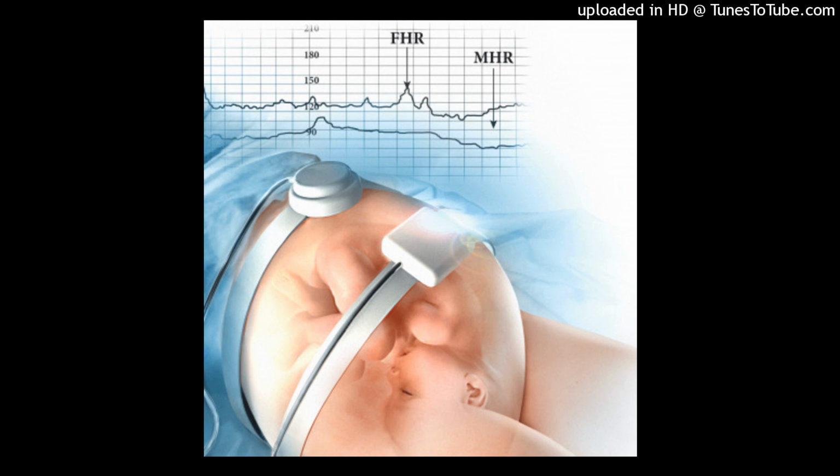Relaxation time is calculated as the amount of time from the end of one contraction to the beginning of next contraction, described in seconds. A systematic approach to these criteria should always be used when assessing UA. Once assessment is complete, the following terminology is used to describe UA.